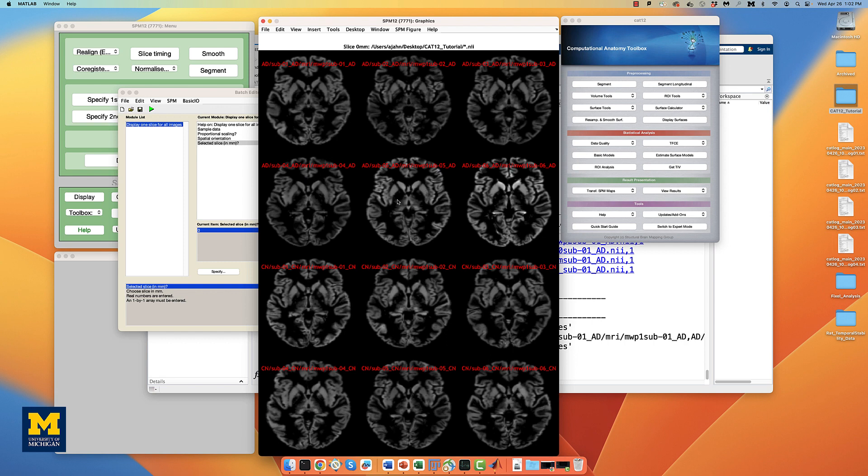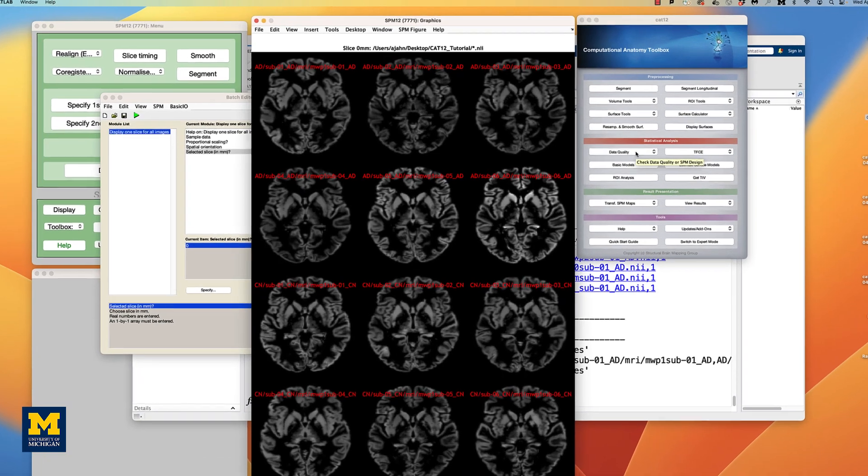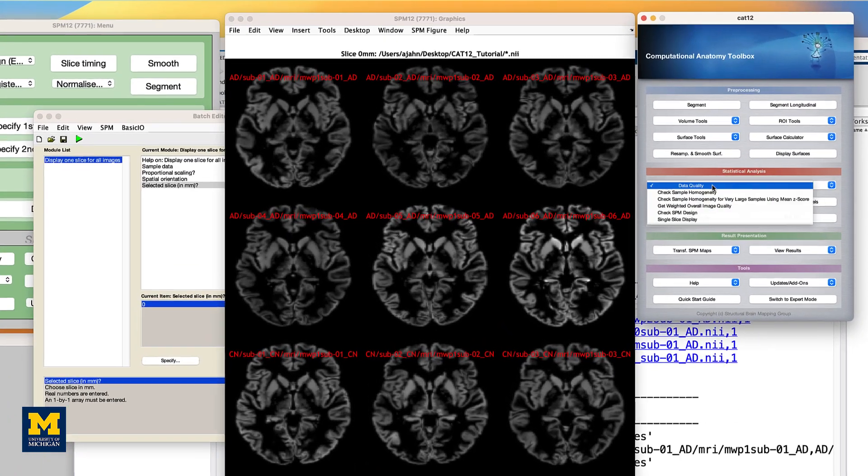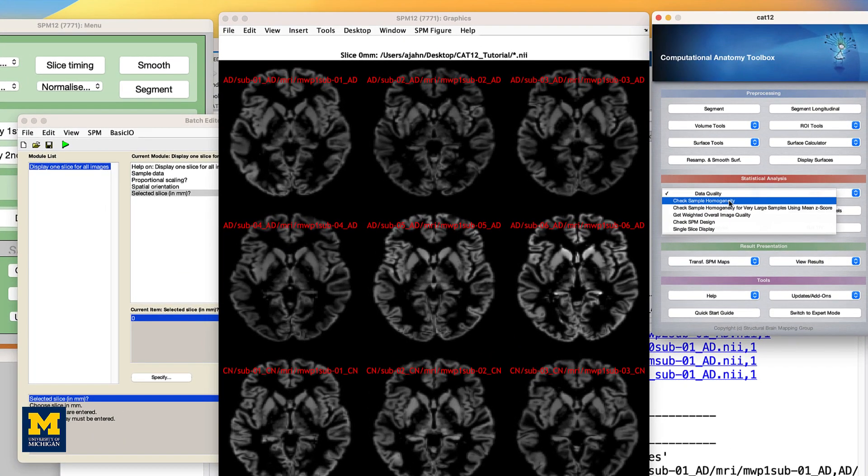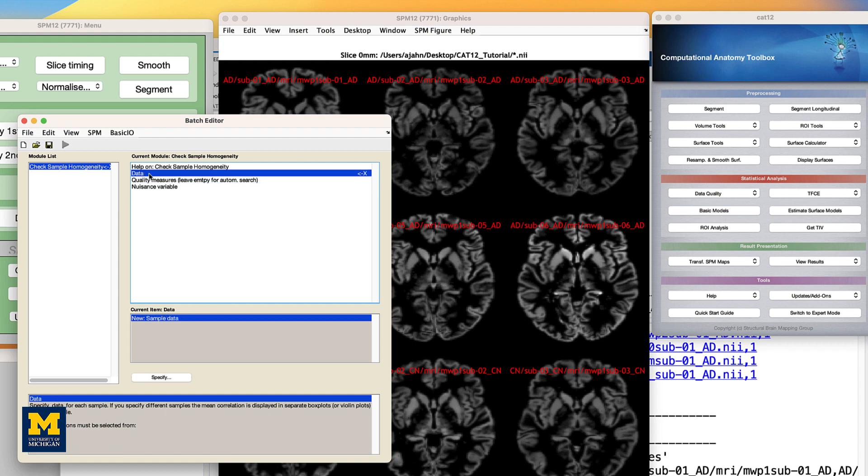Our last QA check is to examine the homogeneity of our sample. Not all of the anatomical scans will have the same volume in every voxel, but most brains should be pretty close, usually in the correlation range of R equals 0.8 to 0.9. From the CAT12 GUI, again click on the data quality drop-down menu, and select check sample homogeneity.